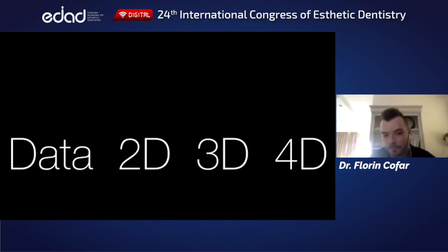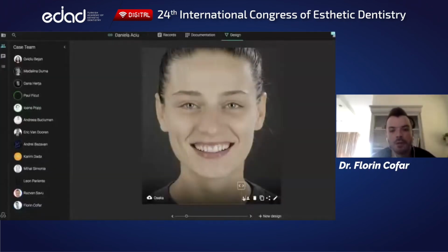Now, let me go a little bit through the steps, and again, I will be talking about two scenarios. One, which is a simple scenario, and another one which is a more difficult case. So we all start with data, which happens at the consultation, and then we usually go to a 2D step.